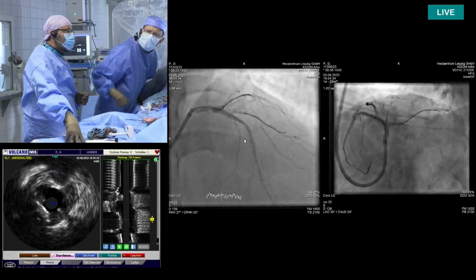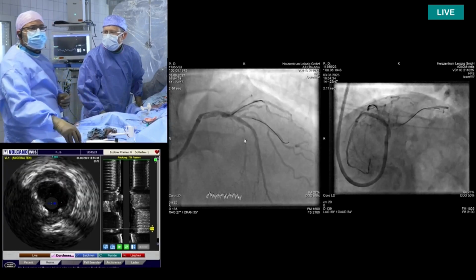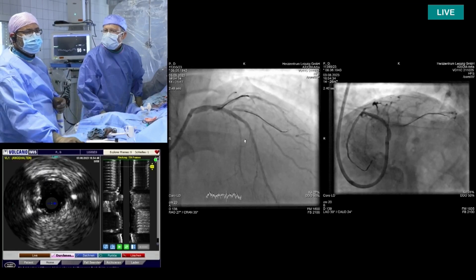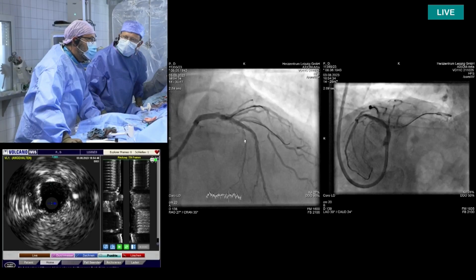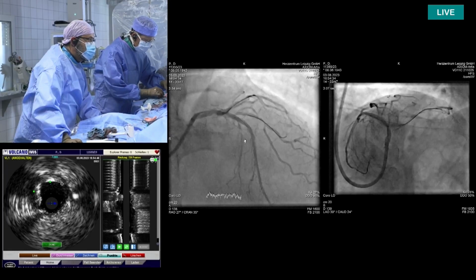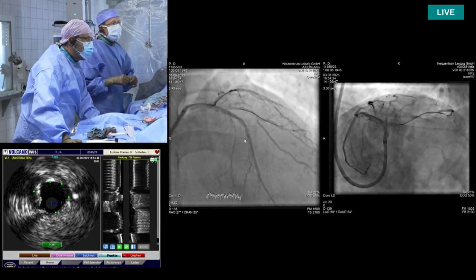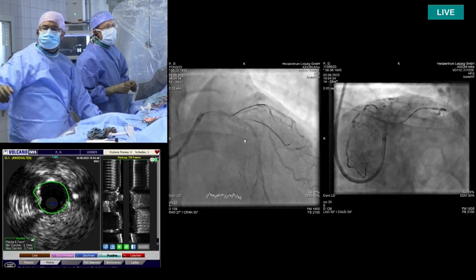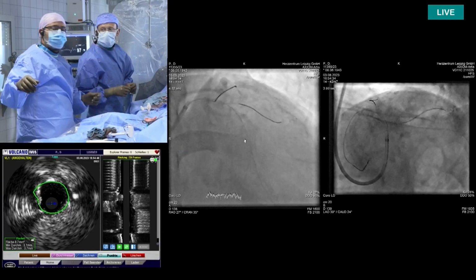Yeah. So let's take 2.5 first. 2.5, yes. But maybe, Carl, can you tell us the distal vessel size? We were not distal enough of the distal diagonal. So 2.5, 28? 28, yeah. Synergy, yes, 28. So we'll start with the 2.5, 28 Synergy in the LAD. Probably we will end up just proximal to this diagonal. And then we end up by overlapping another stent into the left main, 3.5. Maybe we take a Megatron for the left main. Yes. Okay.